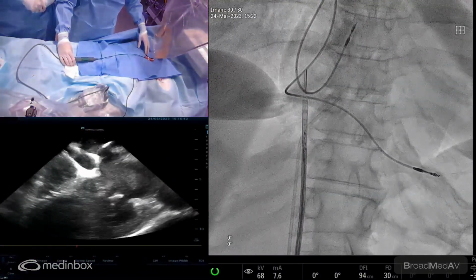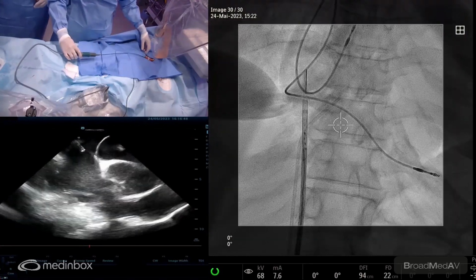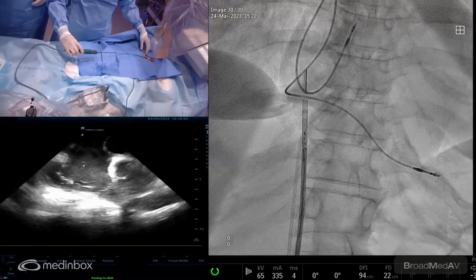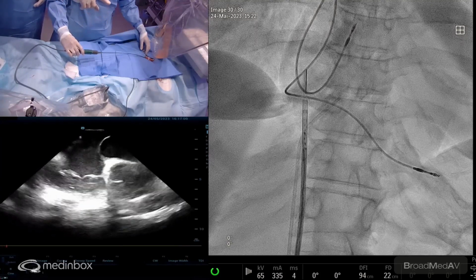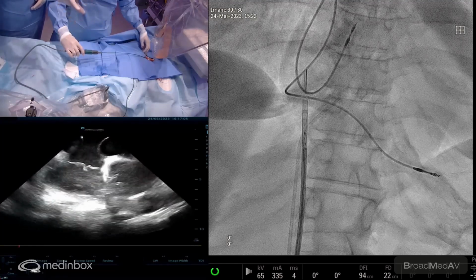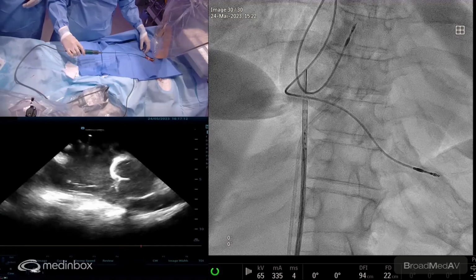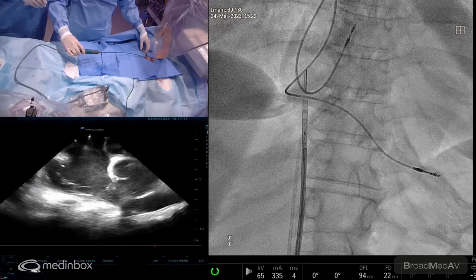If I zoom out here. We want to start always with the home position, and Marcel will show you what the home position is. It's typically something like that. In this view, you see the right atrium, the tricuspid valve in front of you, and also the right ventricle. You have the aorta at 3 o'clock, and you see the bulging of this large septum. It's around 12, the septum, but it's clearly an aneurysmal septum.